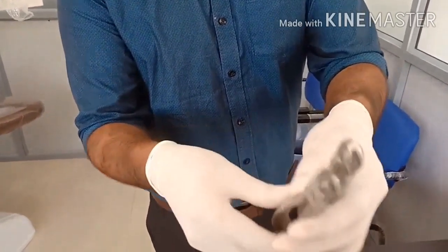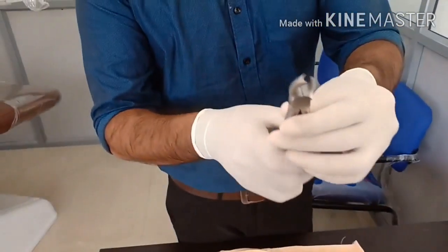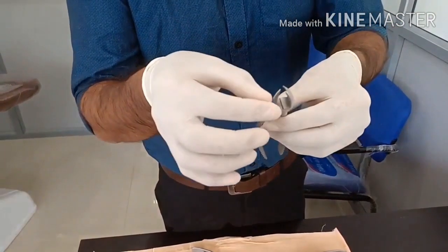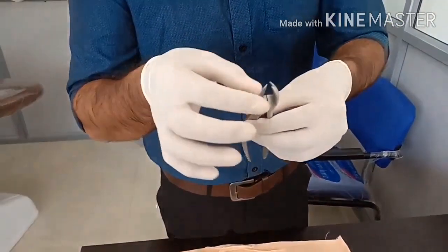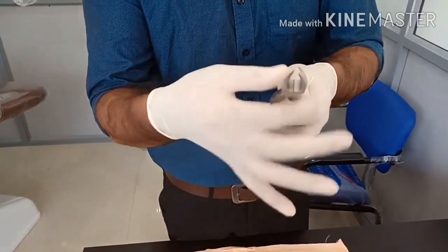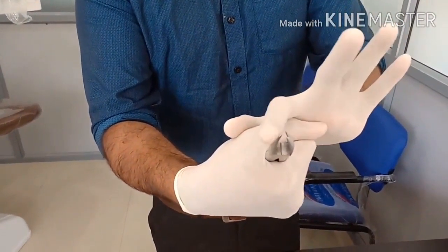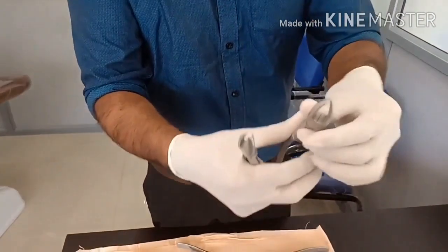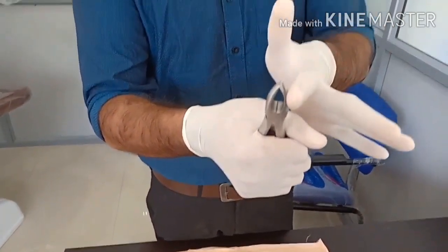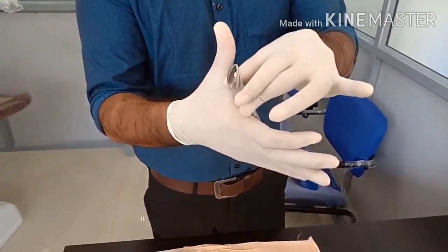There is one more forceps known as cowhorn forceps. If you have a destroyed tooth or very minimal tooth structure remaining, this cowhorn forceps can be used. It has to be engaged very apically towards the root. Again, hold the concavity towards the palm — if the beak comes on the right side it is for the left molar tooth, and if the beak comes on the left side it is for the right molar tooth. It is used for grossly decayed teeth.